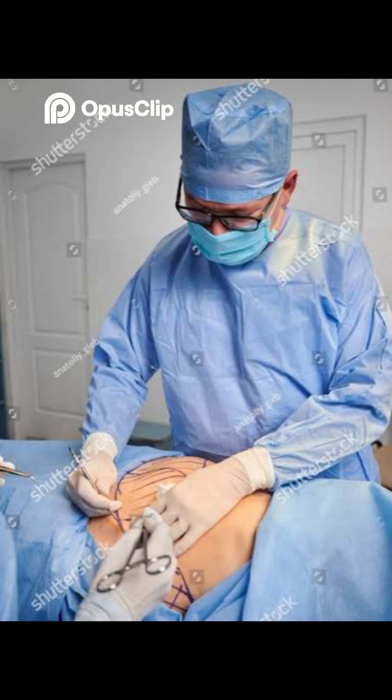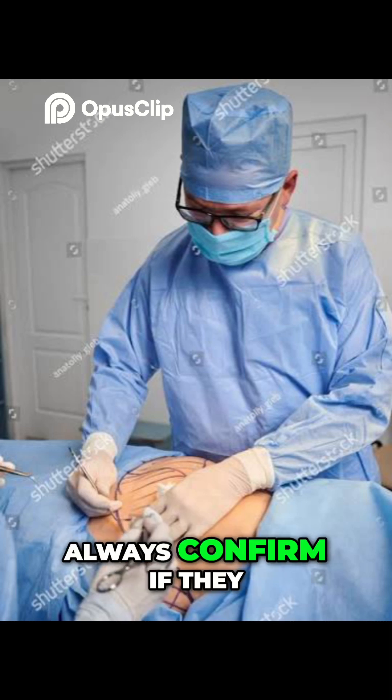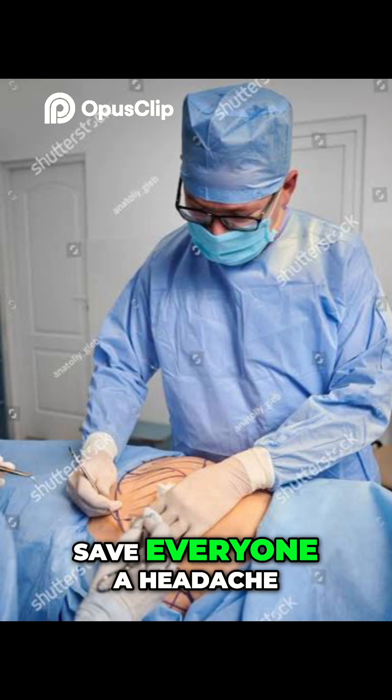Tip 2: Speak surgeon lingo. Doctors have their own vocab — shoot, live, image. Always confirm if they want a single shot or live video. And ask: need the foot pedal? It'll save everyone a headache.